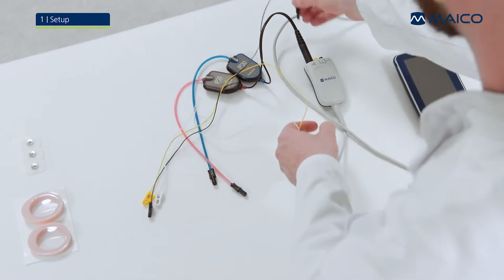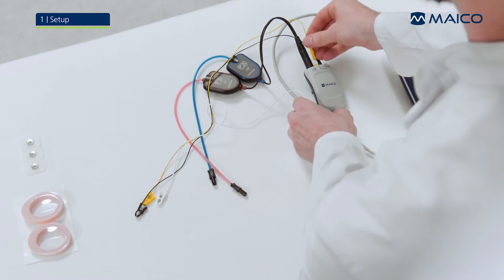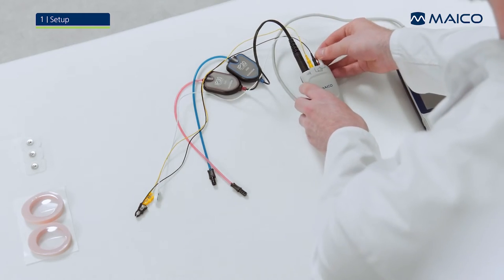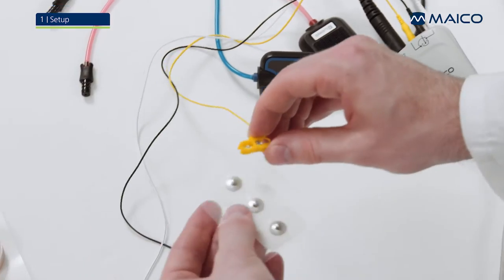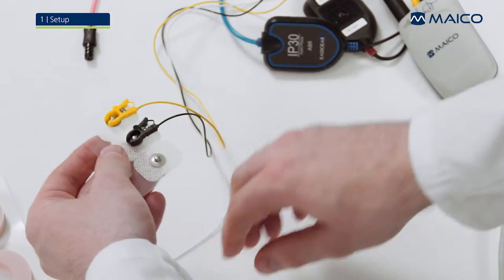Connect the electrode lead wires to the pre-amplifier, matching the colors of the wires to the pre-amplifier jacks. Connect the yellow electrode lead wire to an electrode, then do the same with the remaining black and white wires.